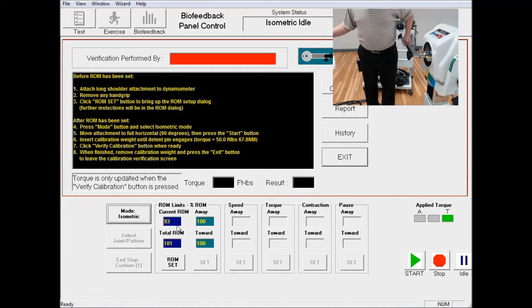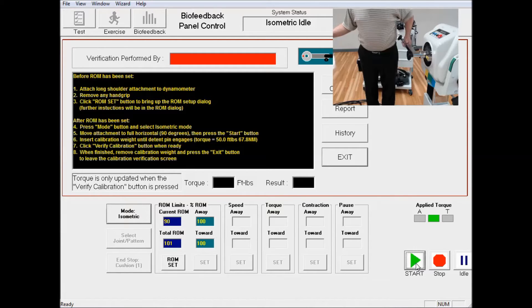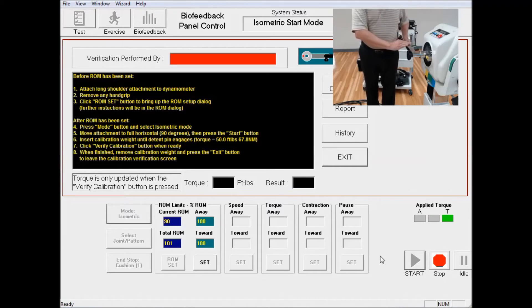Once that is set to 90 degrees, you're going to click on Start. That will lock the attachment in position.